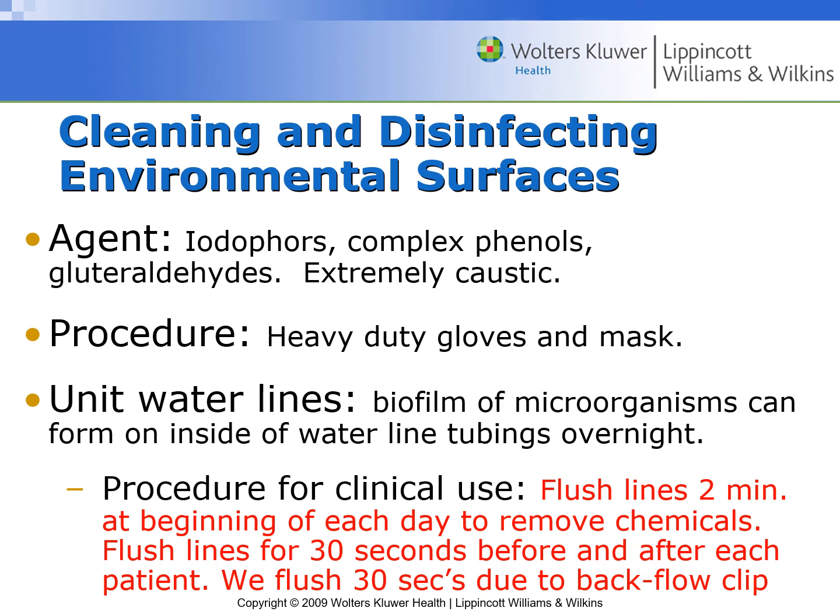If you don't have one of those, you need to flush it for 2 minutes. 2 minutes at the beginning and end of each day, and 30 seconds in between. Since we have one, we can flush our lines for 30 seconds at the beginning and end of each day and 30 seconds in between.